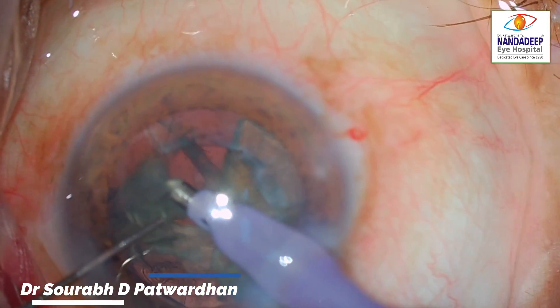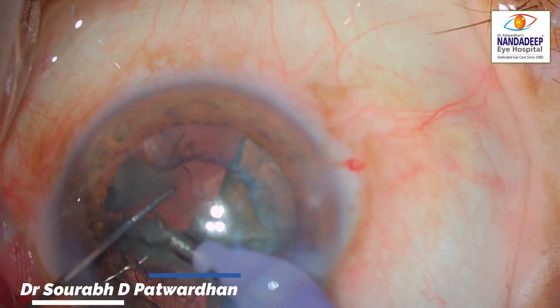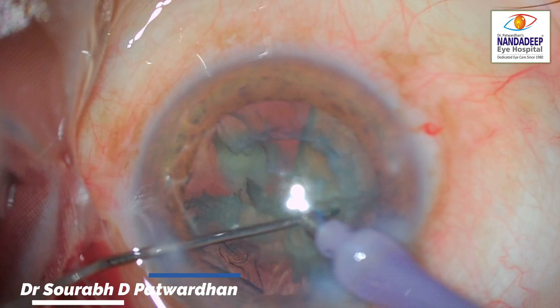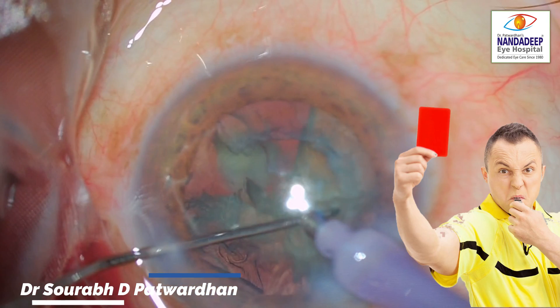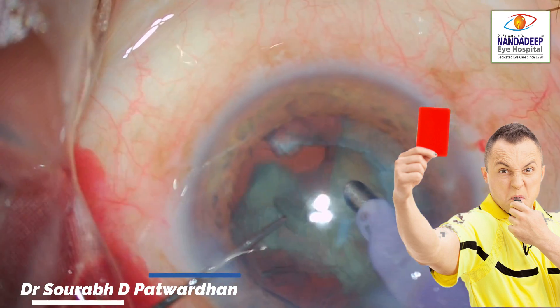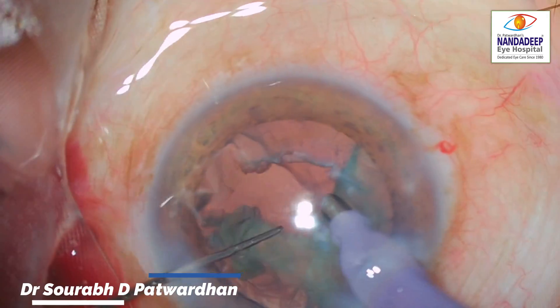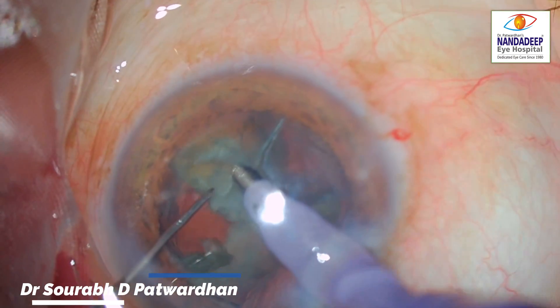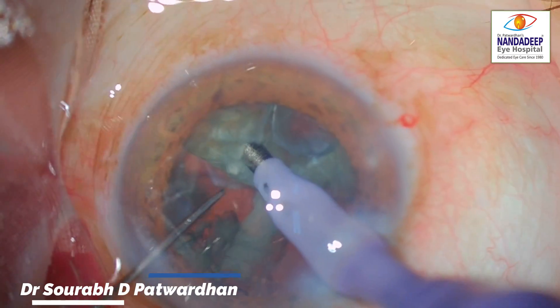Now you can see one piece which is much deeper than the posterior capsule — it has gone into the anterior vitreous. Again, the trainee does not spot this and continues to do phaco emulsification.